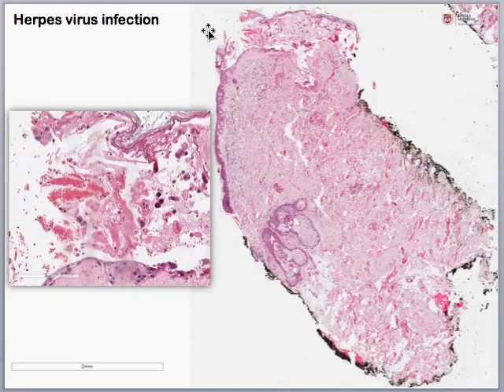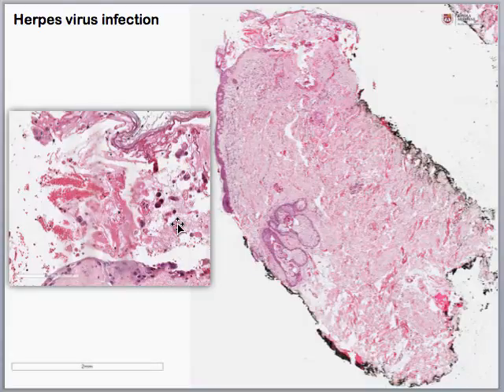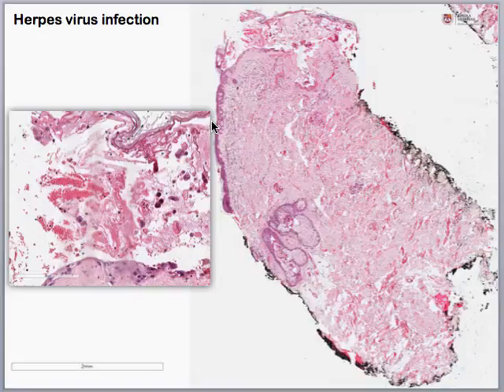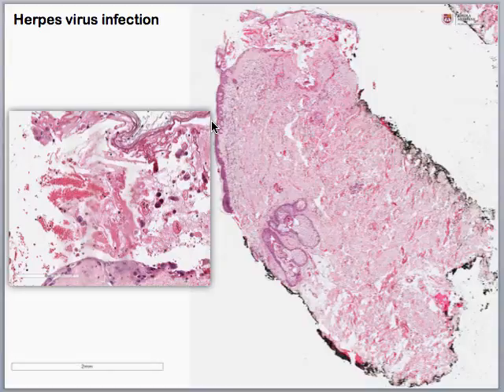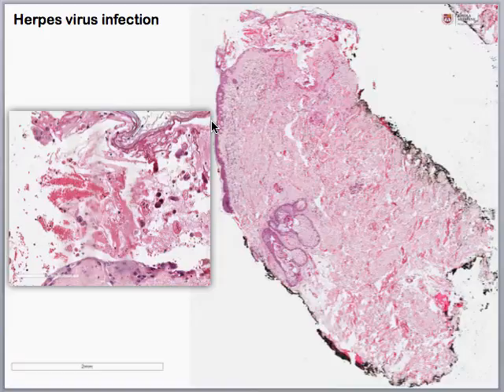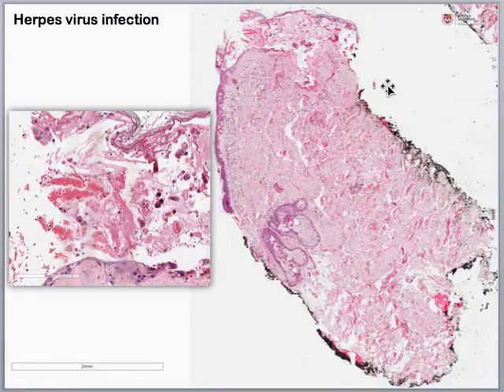Our next case shows an intraepidermal vesicle with acantholytic cells that look a little different from normal keratinocytes because they have viral cytopathic change. Viral cytopathic change is represented by the three M's of herpes: multinucleation — meaning cells can have multiple nuclei; margination of the chromatin — meaning chromatin is pushed to the edge of the nucleus so the center has a clear, glassy appearance with a dark outline at the periphery; and molding — meaning the nuclei hug each other within these multinucleated cells. When you see these changes, think of a herpes virus infection.